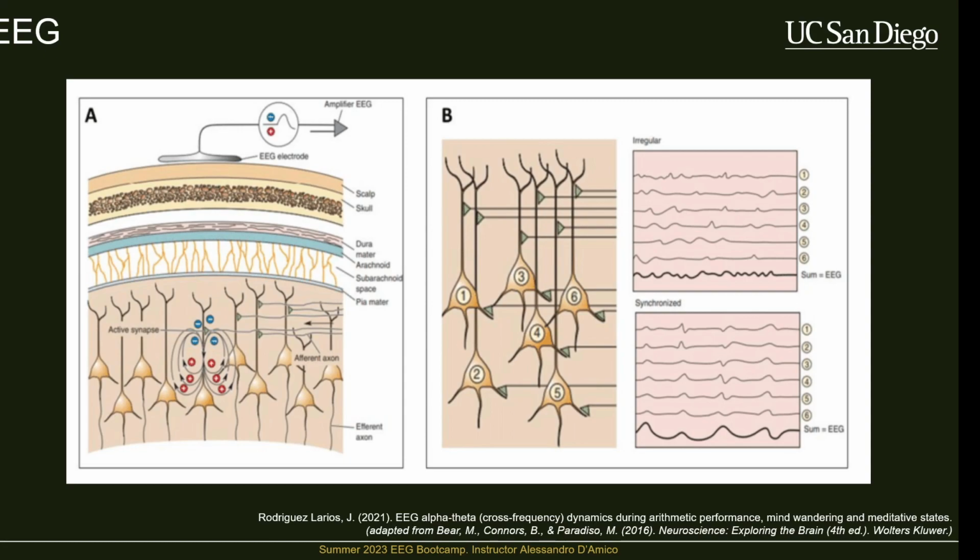You'll see that at around 4,000 hertz, and you can record that with EEG as well. But you're recording more on the brainstem, on channel IZ. So take OZ and go below that, and that's where you're recording that information. So it's a combo. Yeah, the brain just doesn't oscillate that quickly. But then there's also pragmatic limitations like low pass filtering.